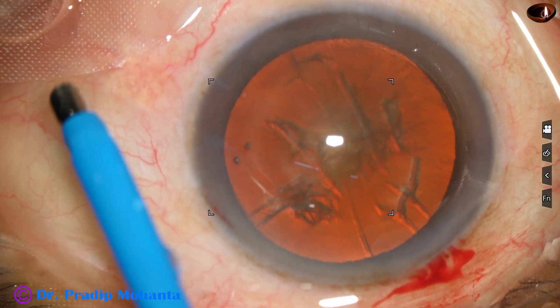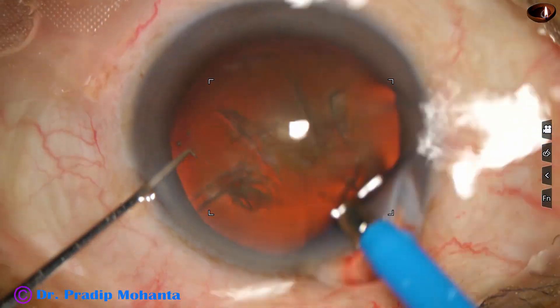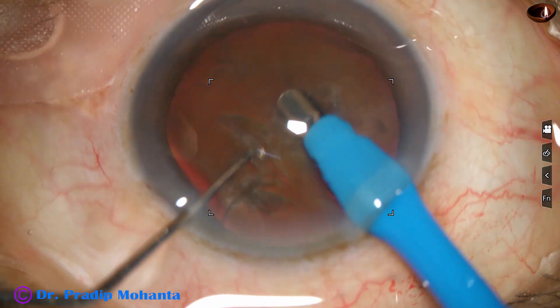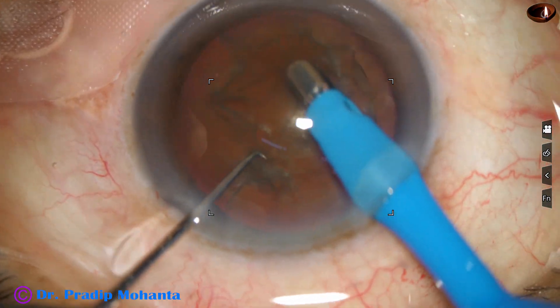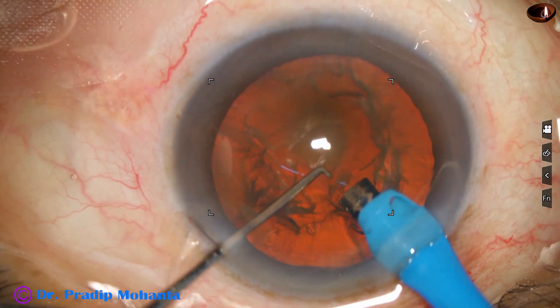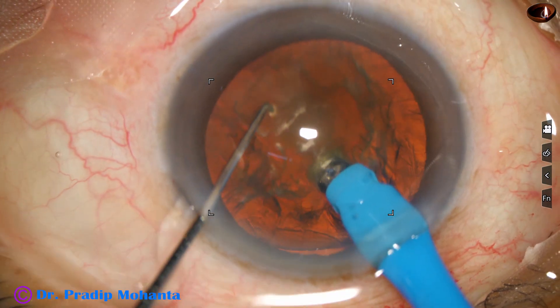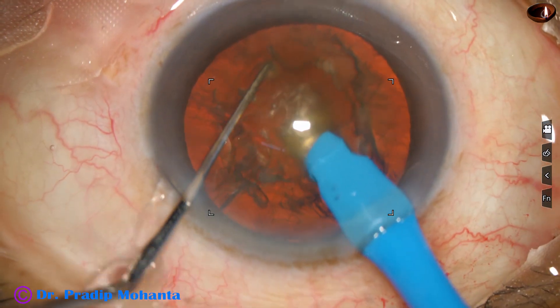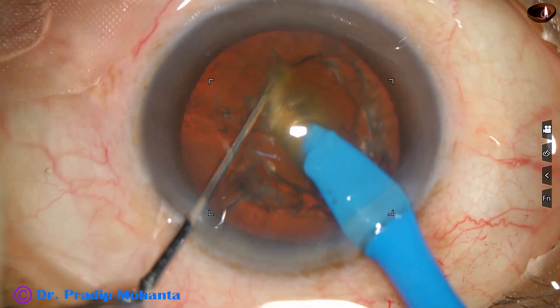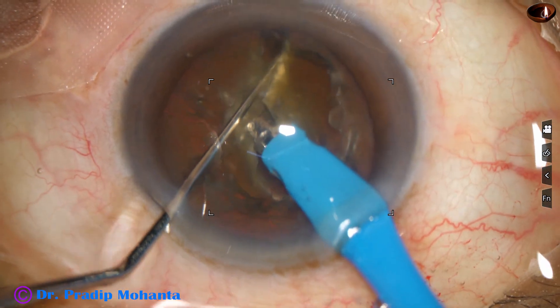Now the phaco needle is introduced into the anterior chamber. The exposed part of the tip is a little more than in routine cases — in soft cataracts — but this cataract is really hard. And this is my technique: submarine chop. The tip goes through the substance of the nucleus towards the opposite equator, crosses the central part, and now the chopper is used to get a nice crack.